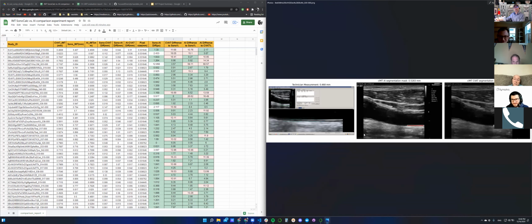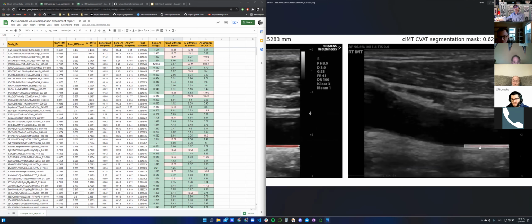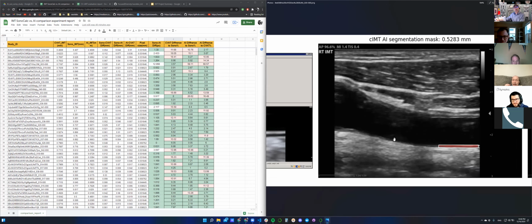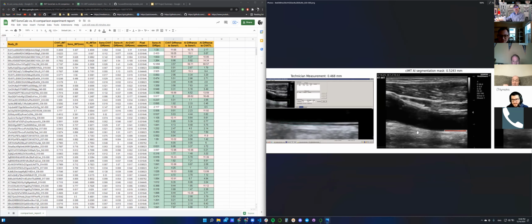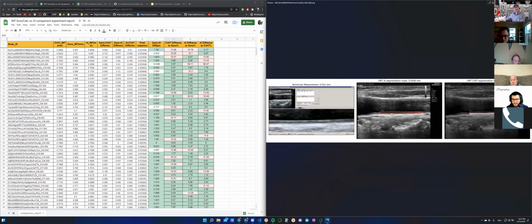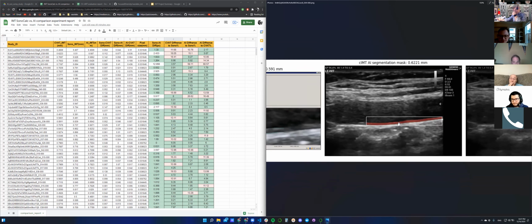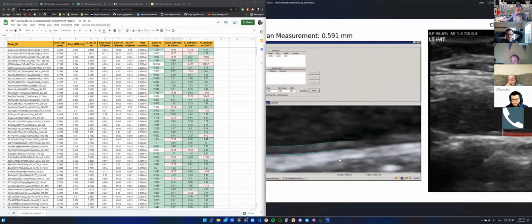Yeah. And also in that case, the technician drew on the far right side, not near the bulb. I think that's because the IMT was more clear there. She didn't take this part, right? So it's a bit subjective about the right region to draw the IMT. But usually, we just heard from Joe that the standard is 1 centimeter proximal to the bulb. So do we need to account for that in our model?